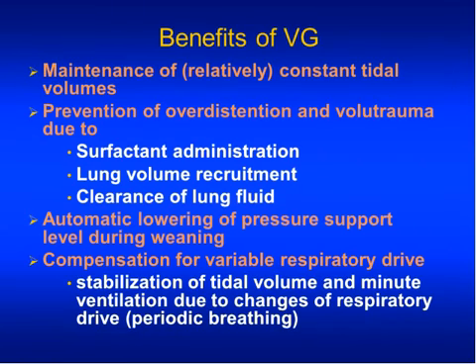It's real-time weaning. Volume guarantee doesn't wait for the next blood gas. It doesn't wait for rounds to make a decision. It's not afraid that the attending will yell at it for doing the wrong thing. It does what it's programmed to do in response to improving pulmonary status and the baby's overall well-being and increased effort. So it leads, among other things, to faster weaning from mechanical ventilation, something that most people agree is a good thing, getting the baby off mechanical ventilation as quickly as possible.